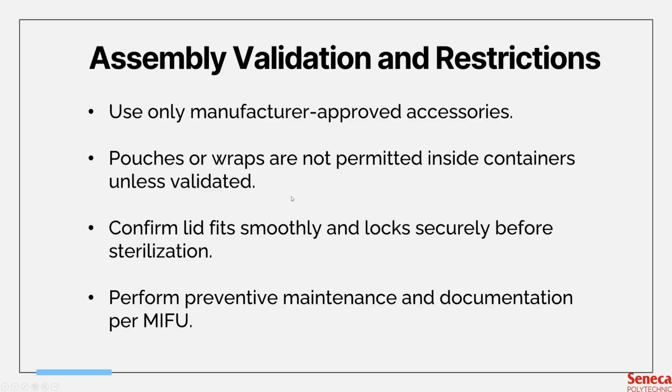And even if they were to validate that setup, it all depends on the facility that you work for, the healthcare facility. Of course, before sterilization, you have to verify that the lid fits smoothly and that the locking mechanism engages evenly across all sides.